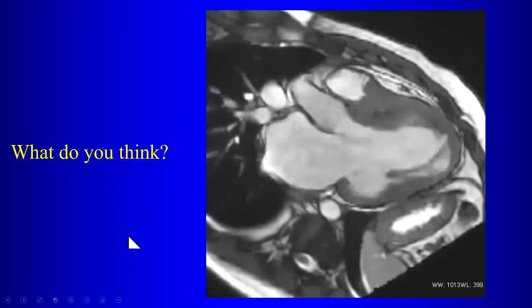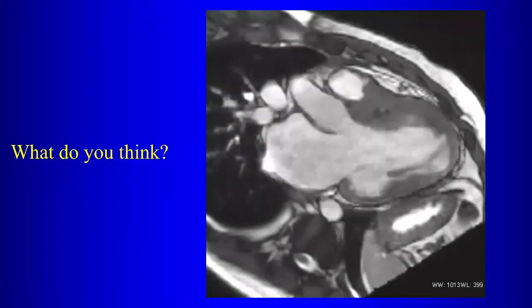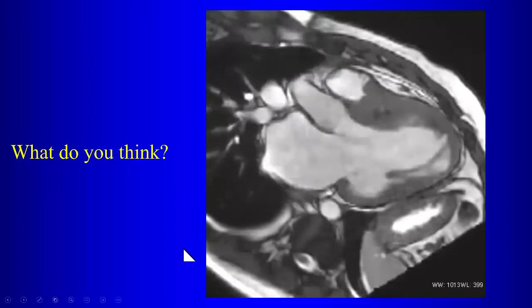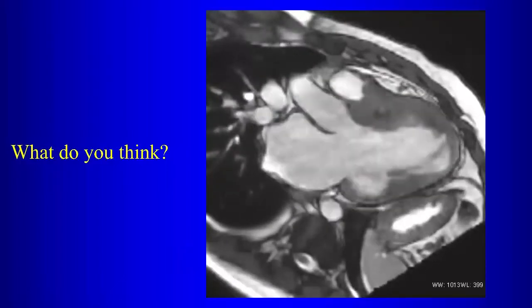Wraparound artifact. What's that bulge? That's a stomach. Oh. A little bit of knowledge, dangerous, dangerous.